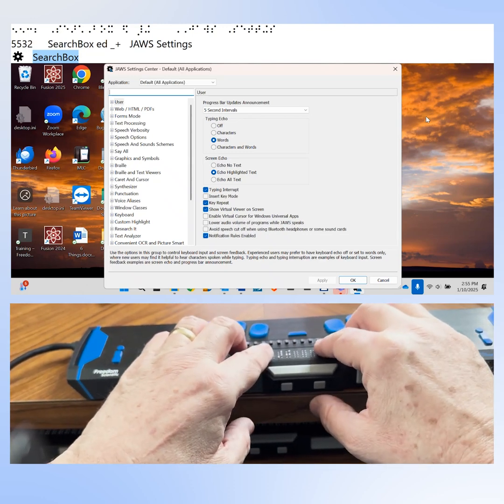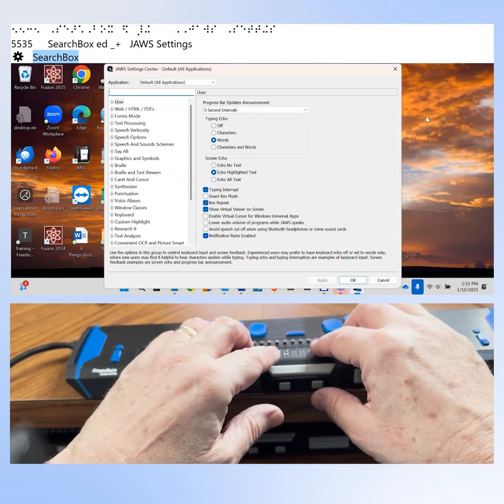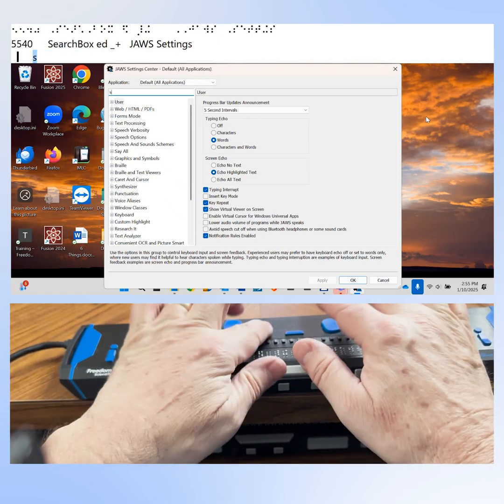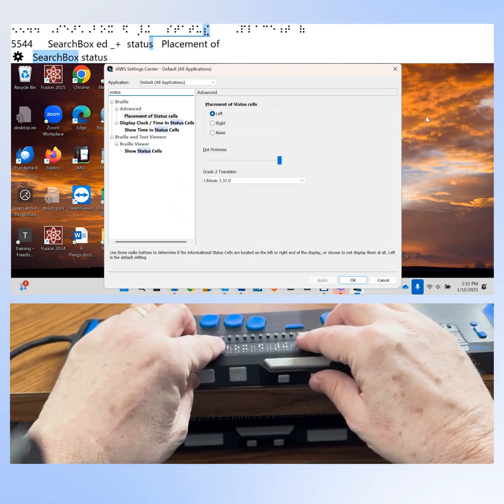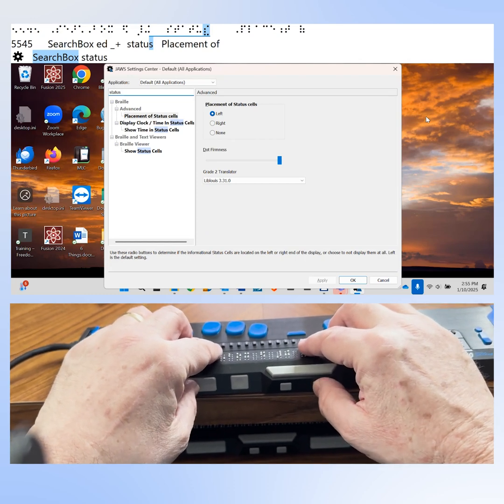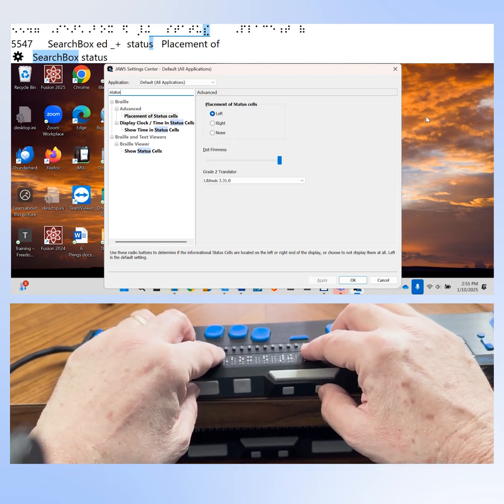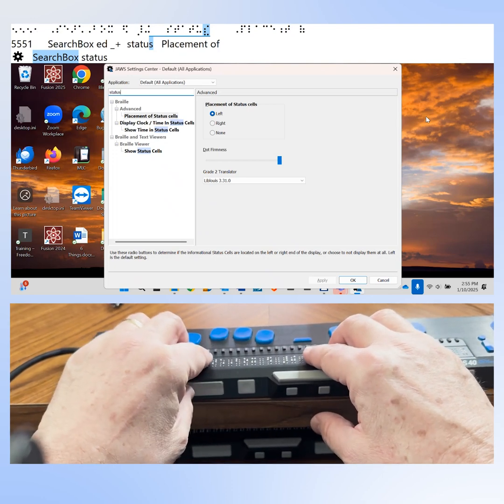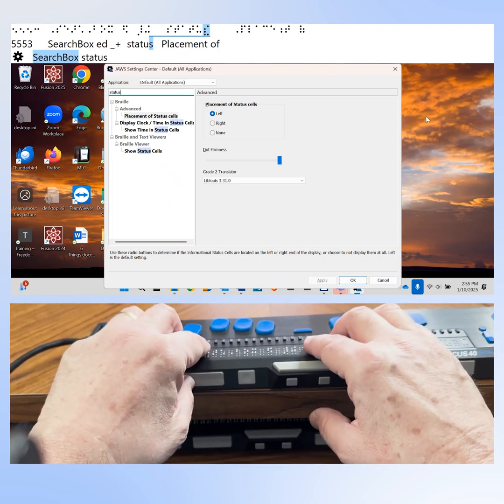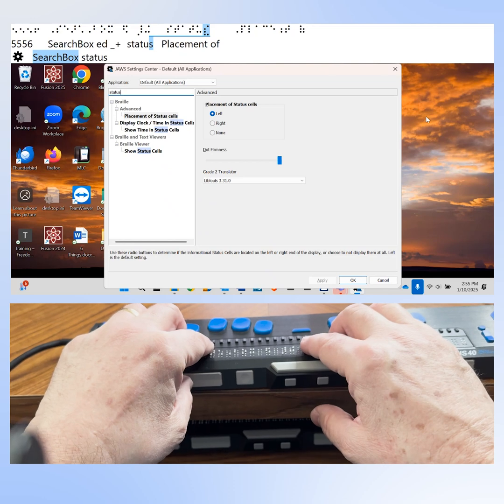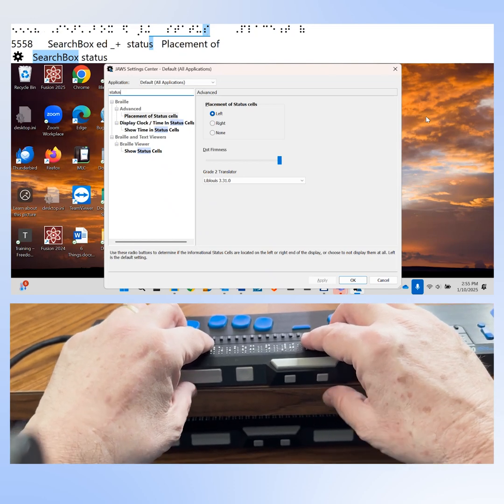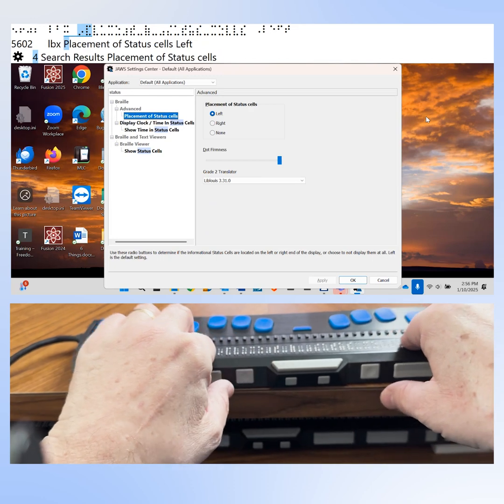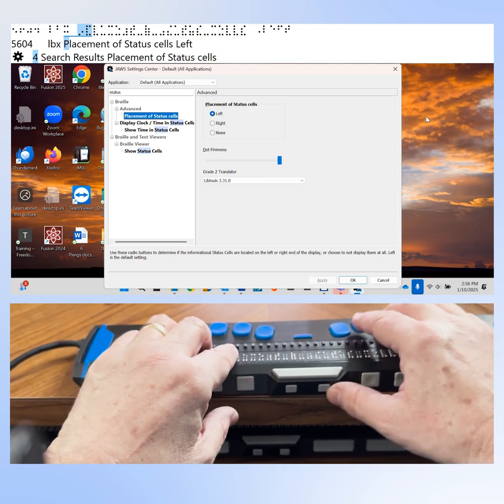JAWS Settings Center Default All Applications. Now let's enter the word "Status" in the search edit field. Placement of status cells comes up as one of four search results. Placement of status cells is the option that we want, but I have to press down arrow to actually get to it, to put focus on that choice. We'll press down arrow using one of the rocker bars on the front panel of the braille display.